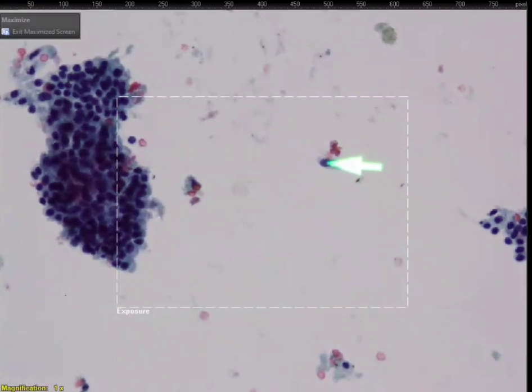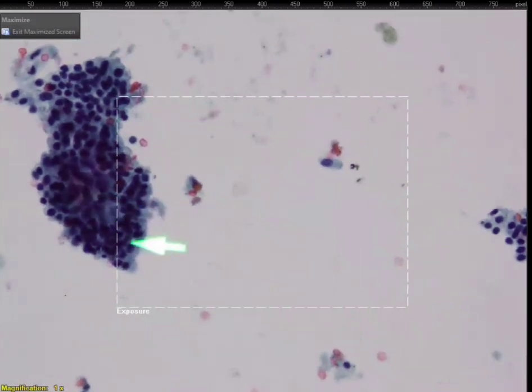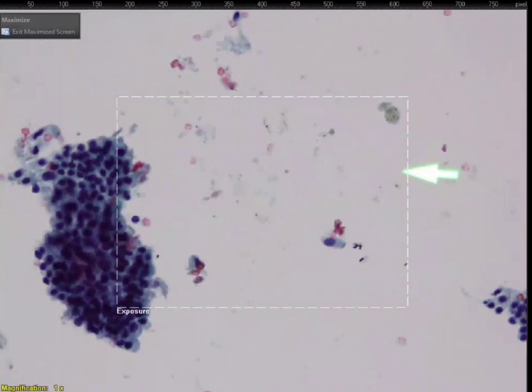So there's your respiratory cells. Do these look the same? Yes, another one up there, nicely ciliated too. But you see, these cells all look a bit different, right? Maybe abnormal respiratory cells.